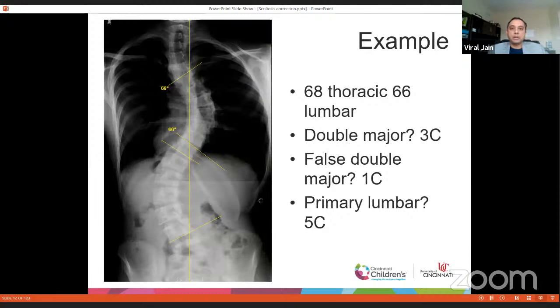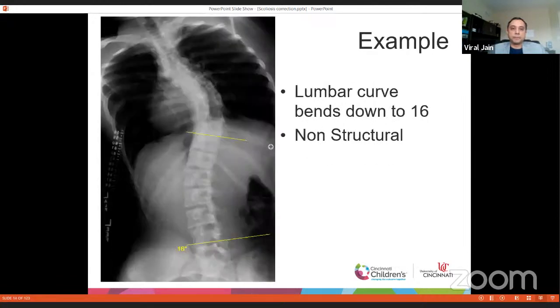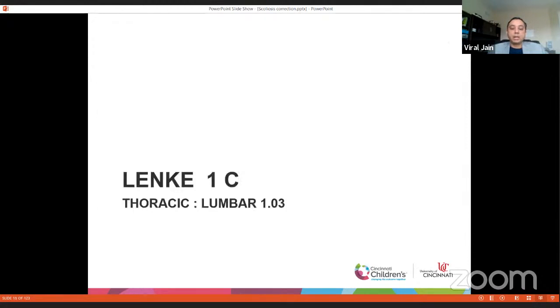Look at this example: 68-degree thoracic, 66-degree lumbar. Based on the anatomy, it looks like both curves are major. The question is whether it is a primary lumbar curve versus a Lenke 1c primary thoracic curve. On bending film, the thoracic is structural, and when the patient bends to the other side, the lumbar curve goes below 25 degrees — so that is non-structural. Lenke 1c, with thoracic-to-lumbar ratio almost the same.